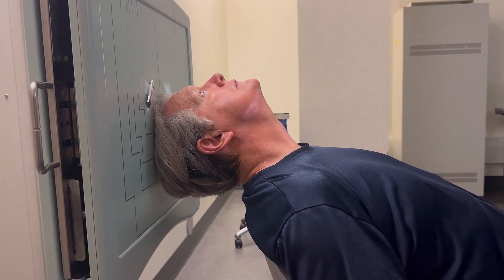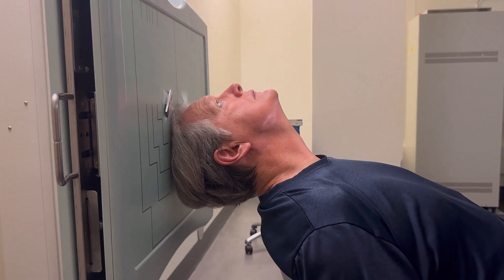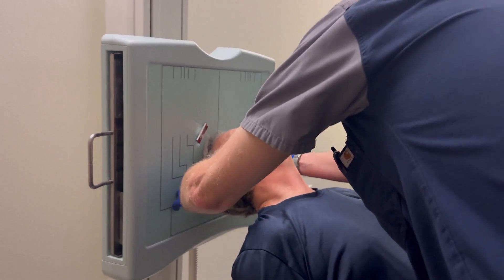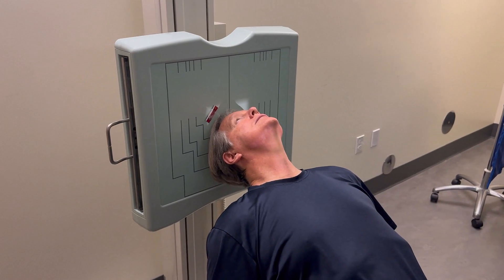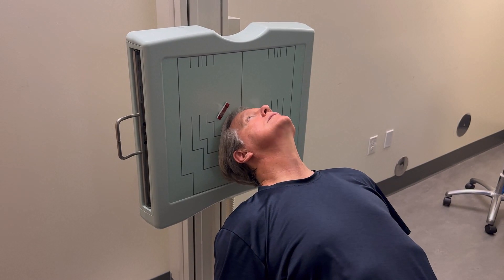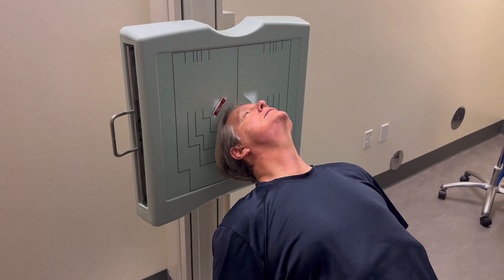You're just kind of framing this. You're going to look in the front to make sure your patient is not rotated or tilted. There's a very small amount of tilt — just need to shift you over a tiny bit. For rotation, you can look at the shadow of the nose; it should be coming right up through that central line on the bucky. Okay, just hold still like that. Don't breathe. Make your exposure.